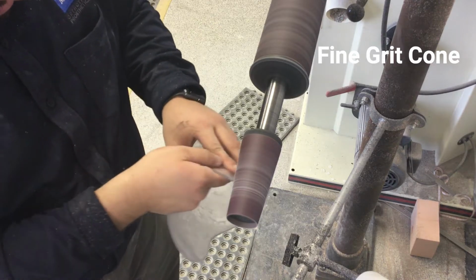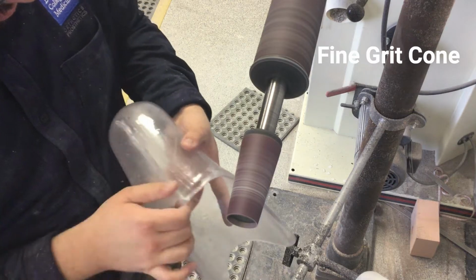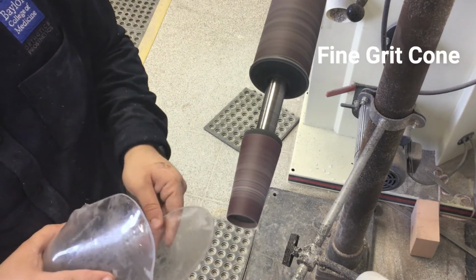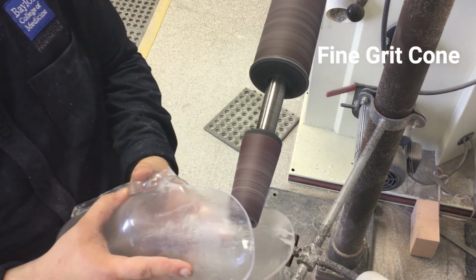Next, we will use the same motion and pressure along the direct top of the socket to further whittle away the edge. Continue this all along the top of the socket.